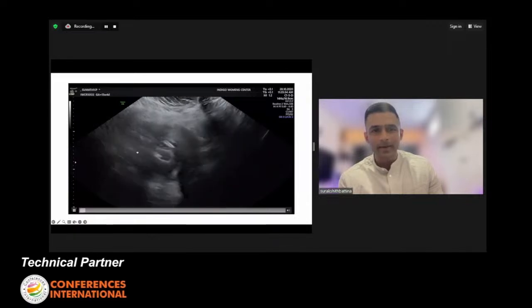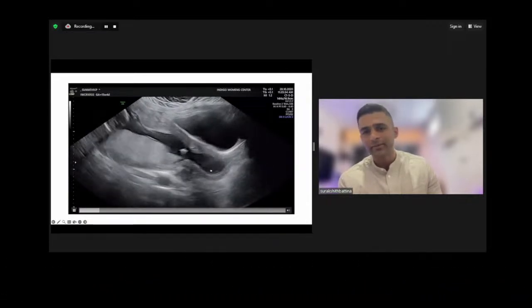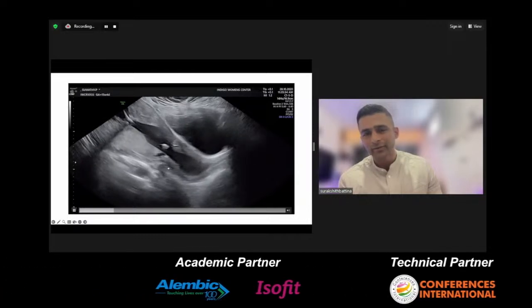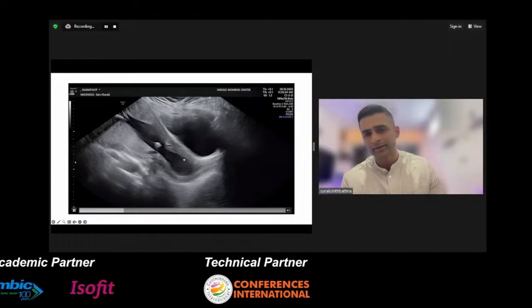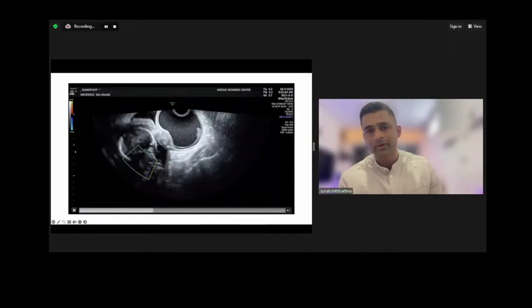And this is another case. It was a very peculiar case. We had a patient who had bulging membranes out of the cervix. As you can see over here, we have placed the stitch for this particular patient anyway, because she insisted on trying. I told her about all the possible risks. I told her that the amniotic sac can break.